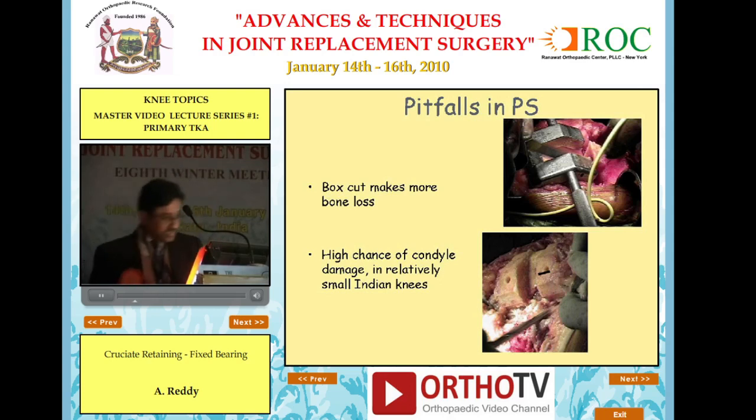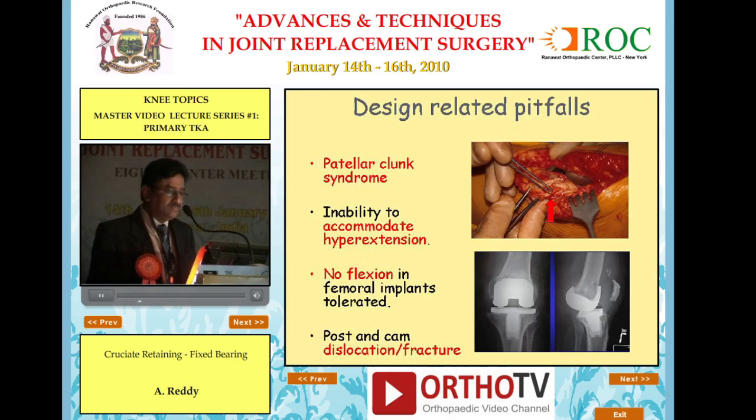And where is the pointer? You can see the small amount of the bone. Which one here? You can see that. And that sometimes is a big box cut. And unfortunately, whatever the size of the knee, the box size is the same. In fact, I was pleading with Mr. Ranawat to reduce the box size in PFC.